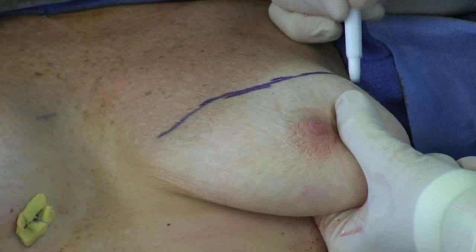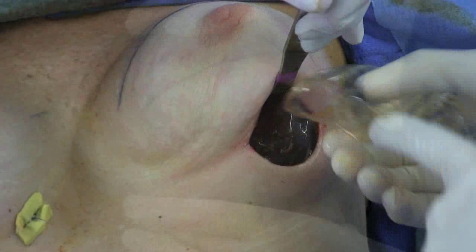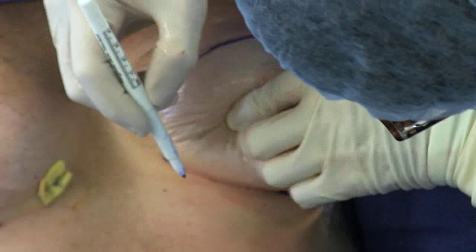The lower border of the pectoralis muscle is marked by feeling its position on the inside. A temporary implant sizer is then placed. The breast is covered with tegaderm sheeting for improved sterility.